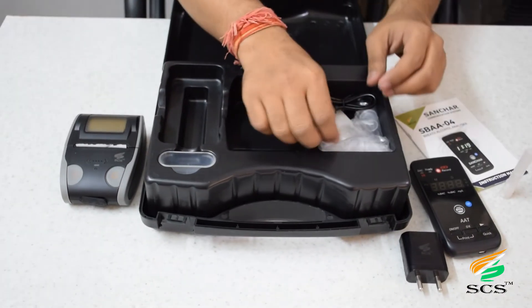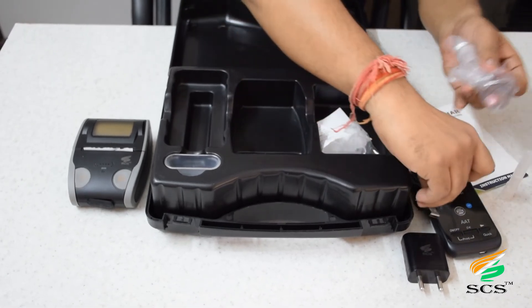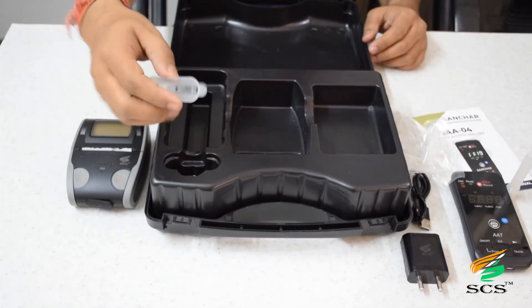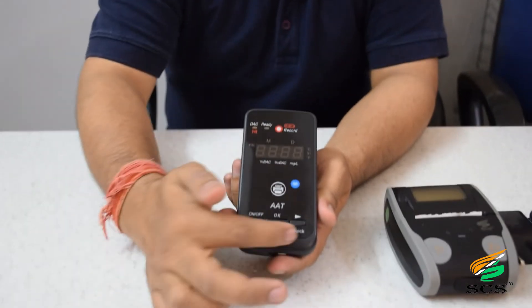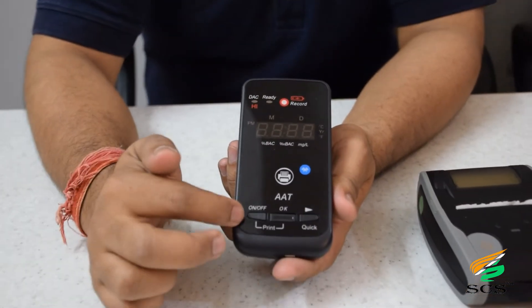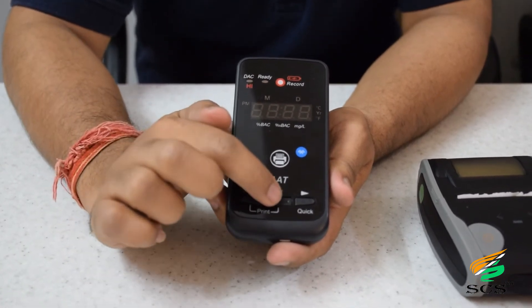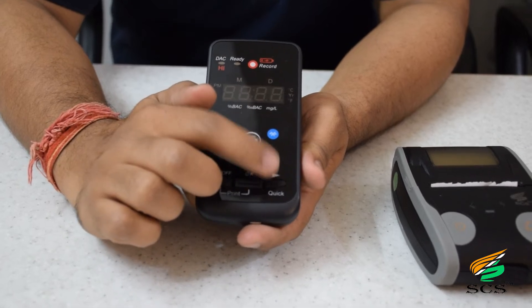This is the thermal roll. This is the cup mouthpiece for the passive test. There are three buttons: the first one is the on/off button, the second one is the OK button, and the third one is the quick button.